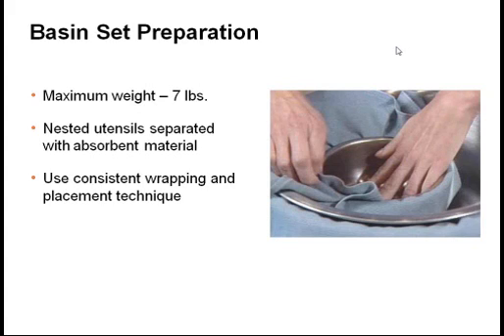Before applying the wrapper, consider the curled rim on the large solution basins, since water can pool in the rim when tilted for sterilization. The rim should be positioned on the wrapper so the absorbent towel used to wick the basins will wrap around the edge, absorbing the condensation to facilitate the drying process.